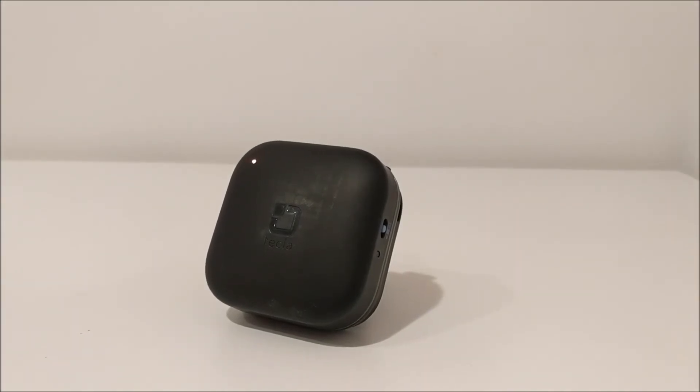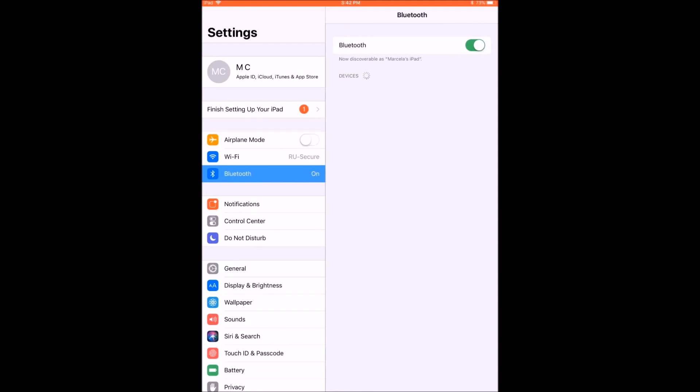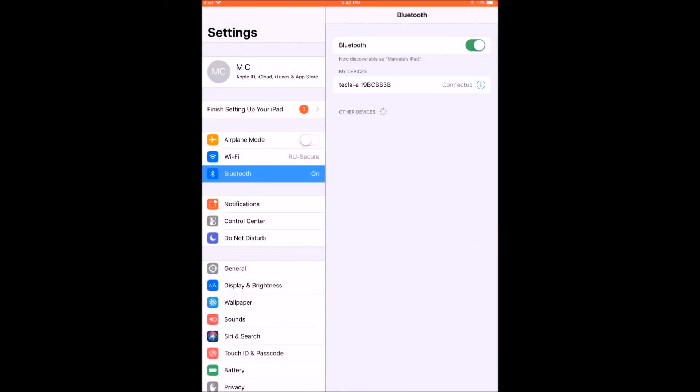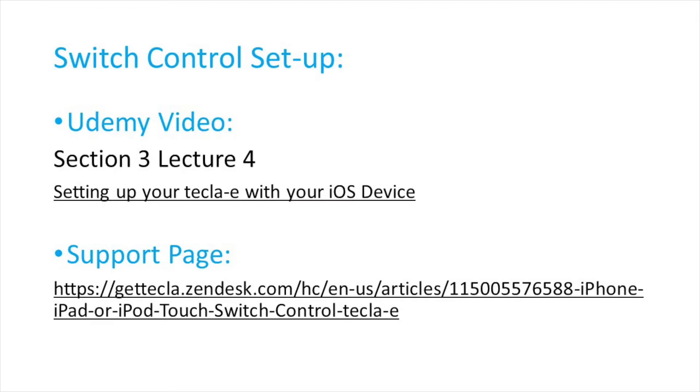Once your device finds the Tecla E, it will show up in the Bluetooth available devices list as Tecla E followed by a string of characters. Go ahead and select this item, and when the pop-up window appears, press Pair. After a few seconds, Tecla E should be under paired devices and appear as connected. Once Tecla E is paired, you can proceed to set up switch control as explained in the setup video for iOS devices.